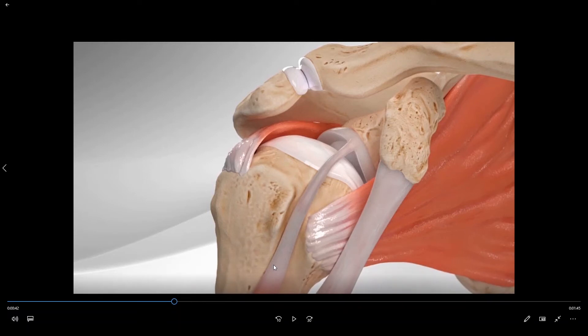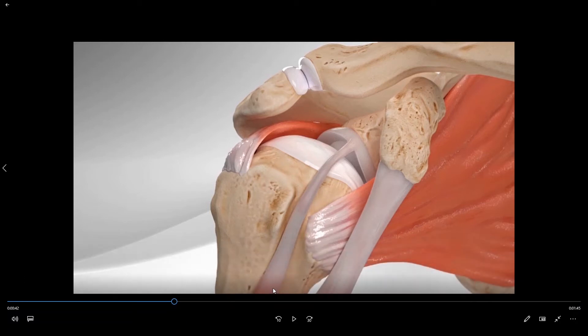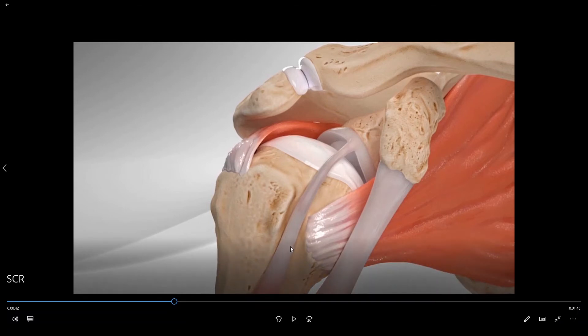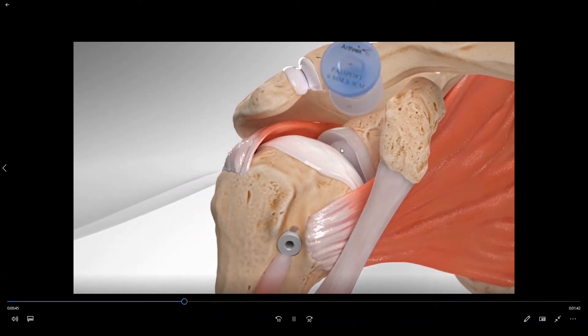Initially, in order to place a superior capsule reconstruction, we need to remove the long head of the biceps tendon. Oftentimes we will simply cut the biceps and allow it to retract down and out of the shoulder joint — that is called the biceps tenotomy procedure. On occasion we will cut the biceps tendon and reattach it over onto the ball, which is called a biceps tenodesis procedure. In this particular video they have performed a biceps tenodesis and removed the biceps from the top of the socket.